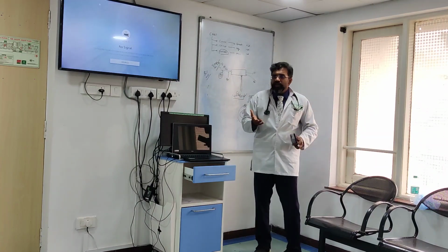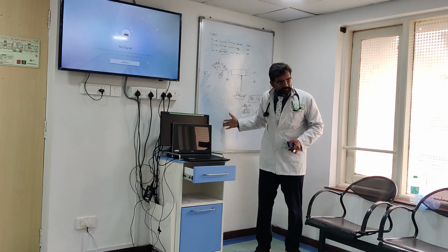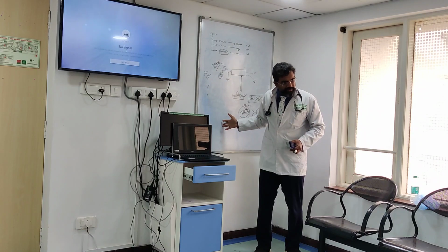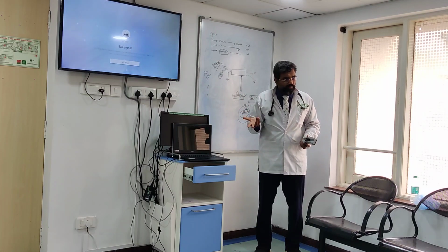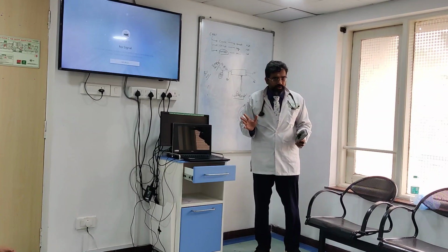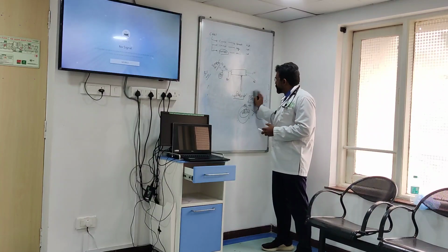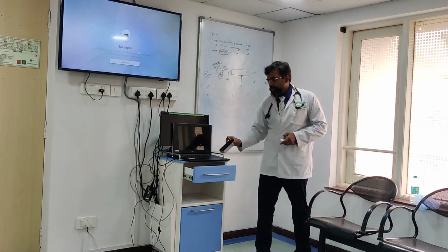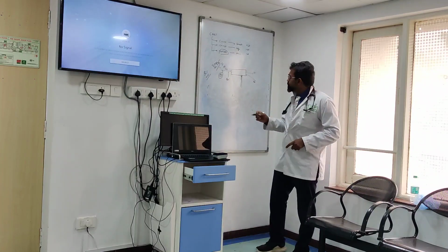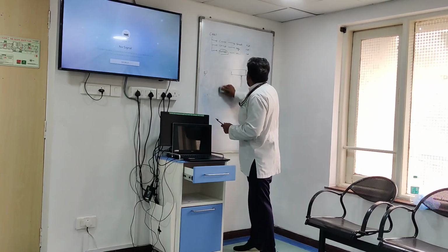So on an average, if you see the ones that I am using, there should be no filter clotting. If you look at 1,000, 150, it is not going to clot my filter. Conventionally, it is not going to clot, it is going to preserve the efficiency. Clear? But somebody asks you, what is the filtration fraction? You should know what is the filtration fraction. So, let's go back to our diagram. I am again drawing you the same thing.